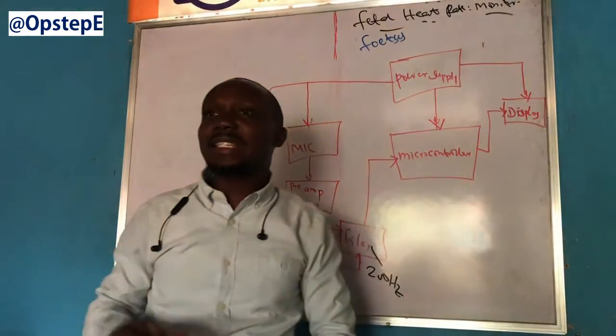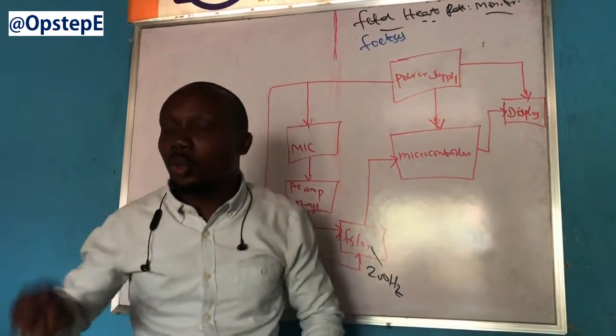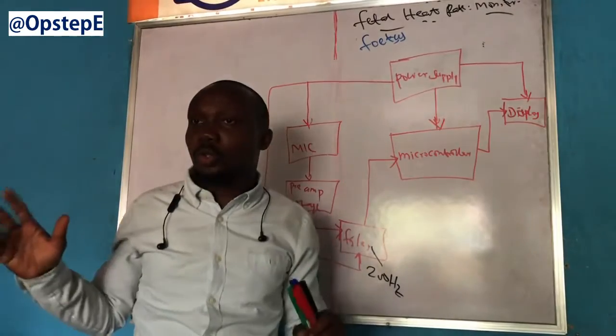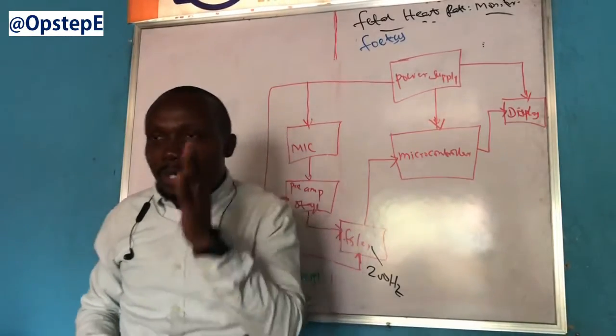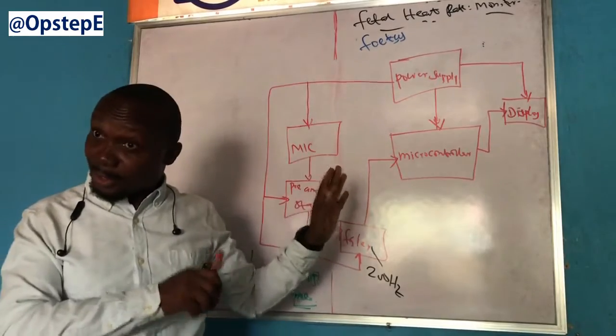Alternatively, if I get a system that just counts pulse, all it does is to count pulse and give to me the amount of pulse it has counted in 60 seconds, it's still going to do the project or do the job, as against gathering every sound possible and then seeing how to actually break those sounds into every pulse. Do you get the point now? That's what I'm saying now.